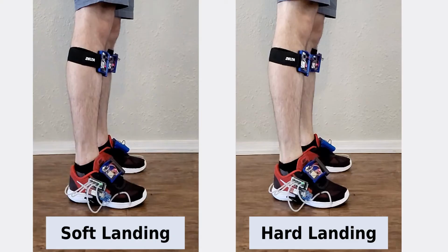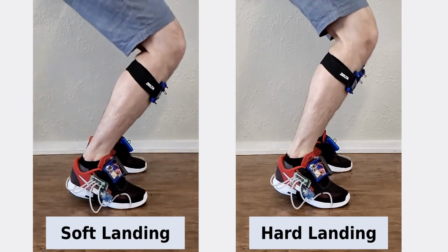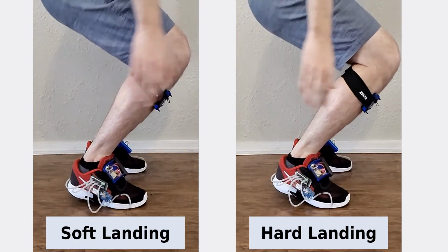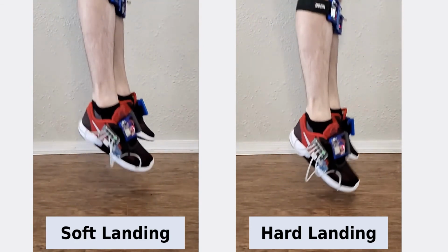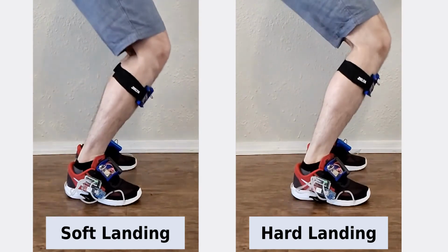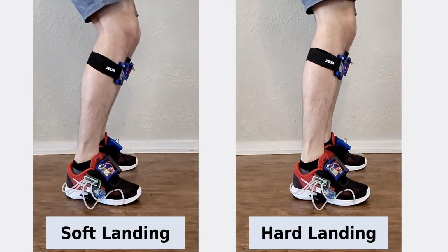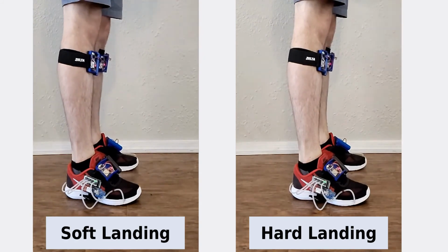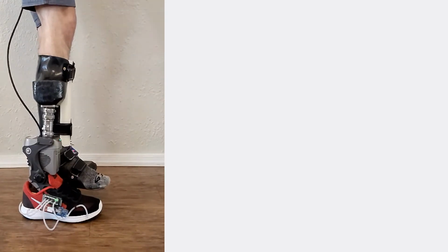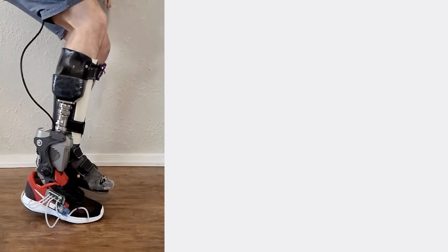control trajectory. To demonstrate our method, we collected training data where the subject was instructed to jump vertically and then land in two ways. First, as soft as possible, and second, with the largest impact they are comfortable with. The data was augmented with joint reaction forces calculated from force sensors and human biomechanics model via inverse dynamics. As you can see, the subject naturally chose to either land softly on their toes or hard on their heels. The learned probabilistic model with our MPC extension then controls a powered robotic prosthesis with a parallel spring mechanism, namely the spring-active ruggedized Odyssey ankle.